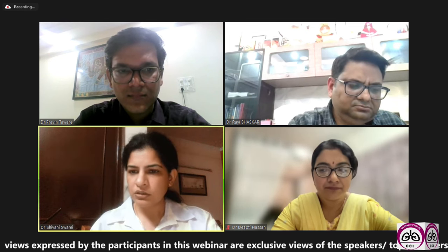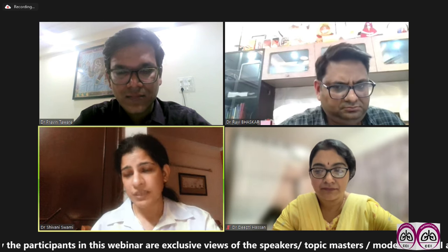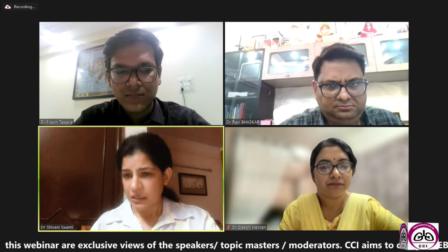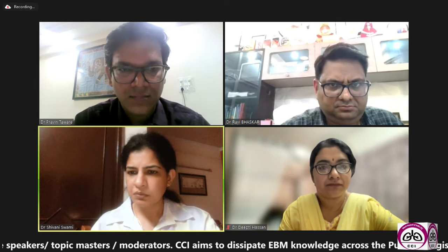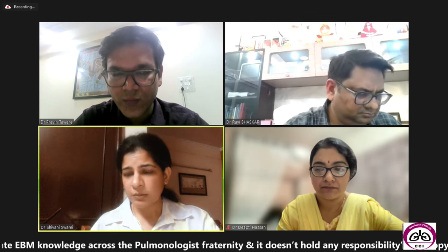Like you mentioned in your talk, in a healthcare setting, the nebulizer is often shared amongst multiple people, even if the mask, of course, is patient-specific. However, the device is probably shared in the hospital for multiple people at the same time. So is there any specific care in terms of cleanliness other than changing the filter? Because the filter is not changed every day, of course. Are there any specific precautions that we have to take so as to avoid spread of infections and all that?